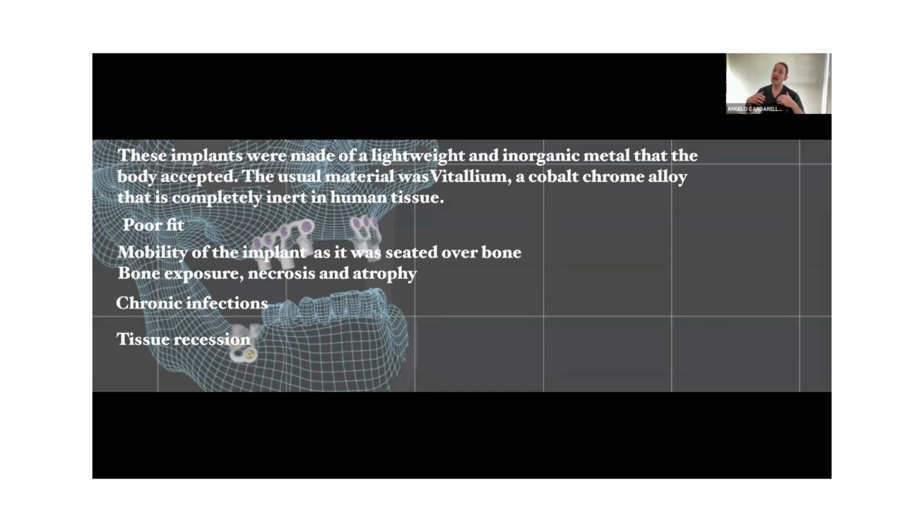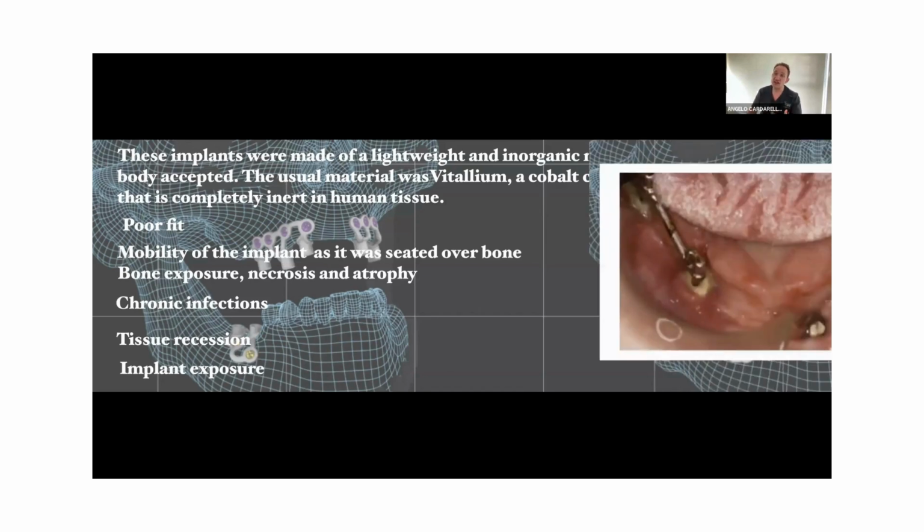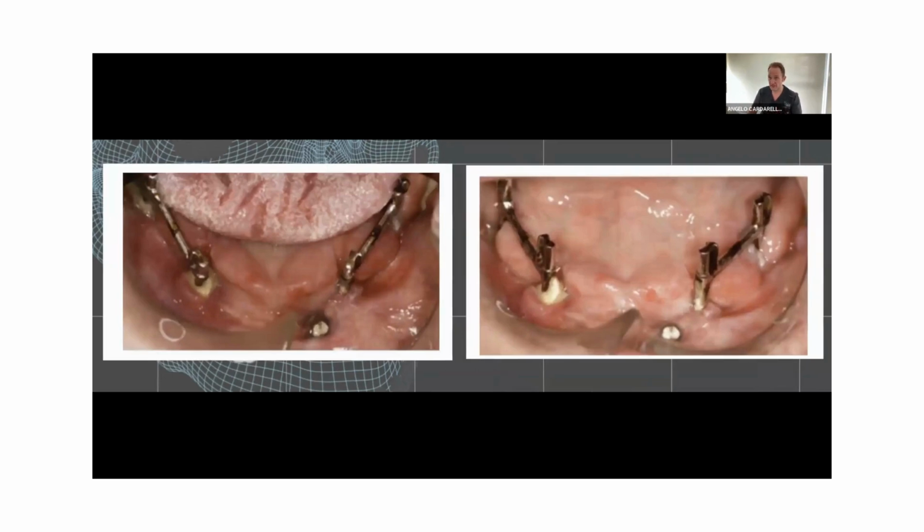So we will have a huge soft tissue exposure, infection, and failure. Now it's different, and I will show some cases in which we can use many screws according to the clinical situation in order to fix and in order to stabilize this kind of customized implant. And again, the surface, it was completely different. This is the past. Have a look.